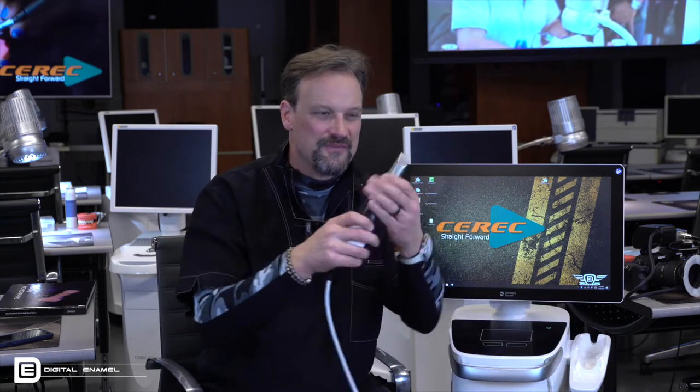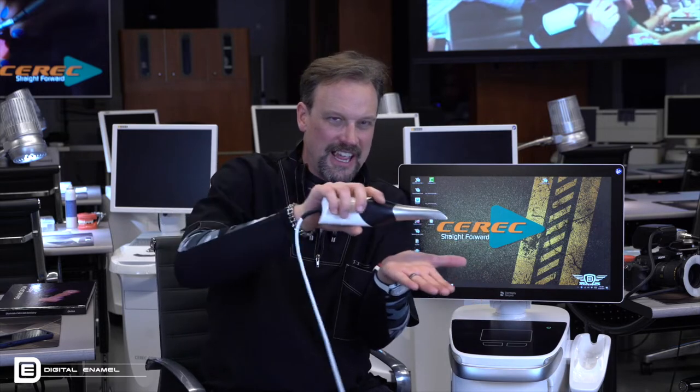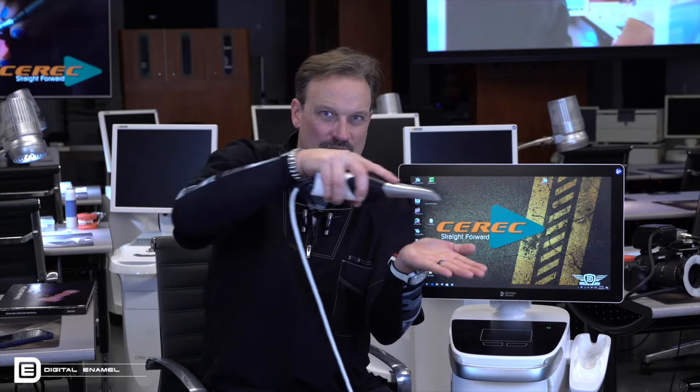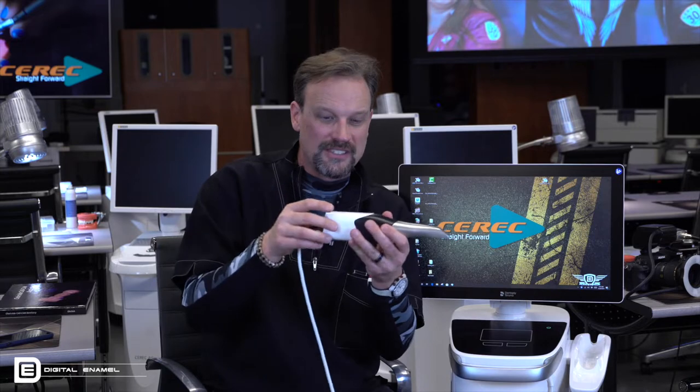So think of it like this. This is the screen of the PrimeScan. We've got the screen here and then the base, and we're going to scan teeth or gingiva or whatever it is. As it's coming across, it's laying down a grid really, really fast, and then the data is coming back into it, but there's time for light. The light has to come out and go back in and then process it, which it's got a computer on board, so it's doing a lot of great things with that.